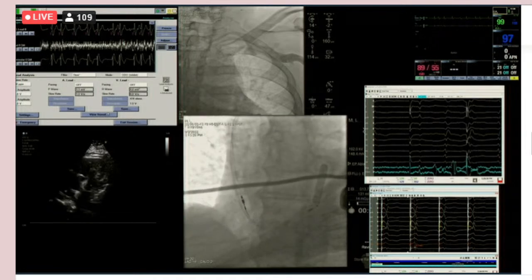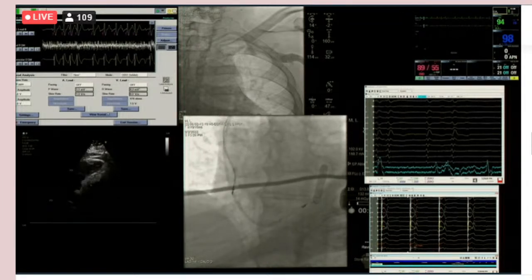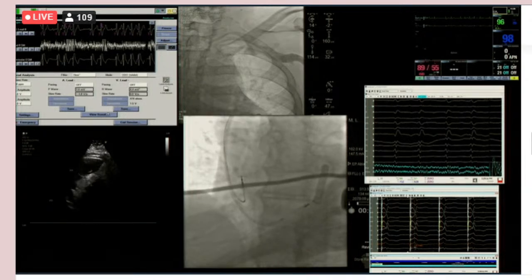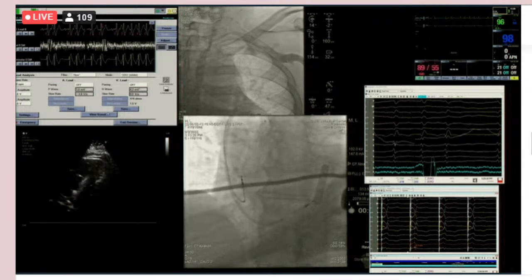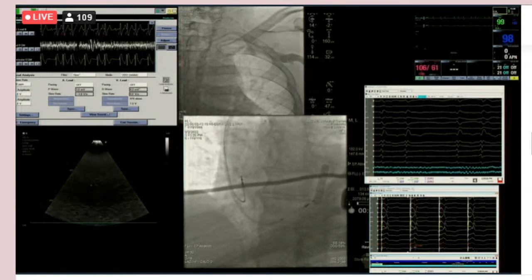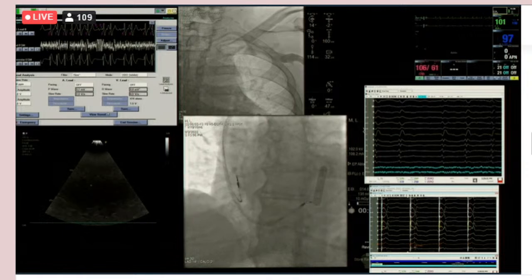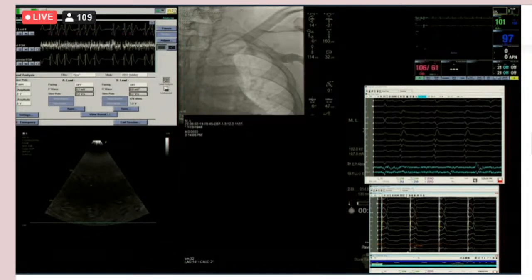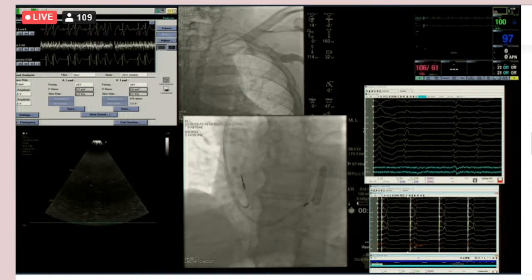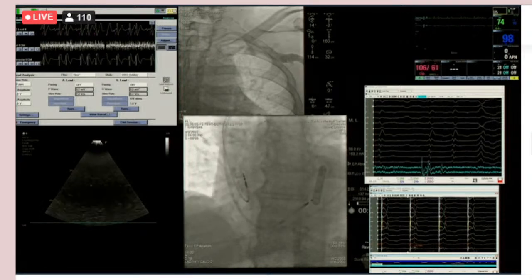And in terms of programming this, you really don't need MVP, I suppose, right? No, so I personally, once we started doing this, I put this in people, whether they were going to use the ventricle or not, because I wanted to get the opportunity. So now you have the option. You don't have to pace. I don't personally think that you need to force RV pacing, but this guy is having intermittent heart block. So it wouldn't totally shock me if 6 months from now you can't avoid pacing the ventricle. And so at the moment we could probably justify it.